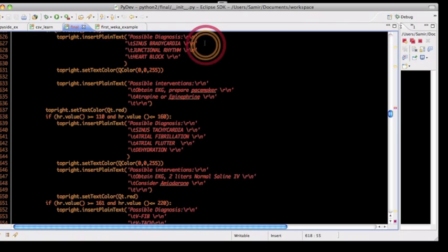I also demonstrate that a combination of different variables out of range can come up with its own diagnoses. For example, the arterial blood gas values, even in times when pH is in the normal range, can be considered acidotic or alkalotic, but is determined by the other variables obtained in the arterial blood gas, such as carbon dioxide level and bicarbonate level. I will take five variables that indicate early sepsis and combine them together to show that a sepsis protocol is recommended in that certain situation. This is important because sepsis, when caught in its early stages, decreases a patient's hospital's length of stay considerably.